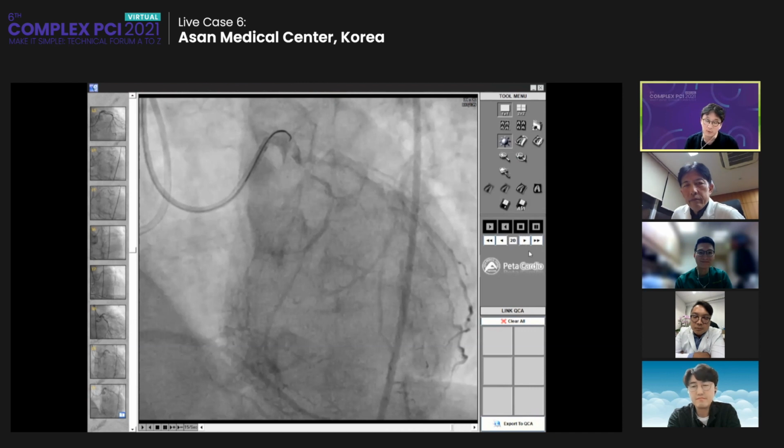And of course, we may not have the detailed information from that previous session, but I thought that the method of the parallel wire technique was incorrect in this session. I think they did not use an appropriate view for the parallel technique.